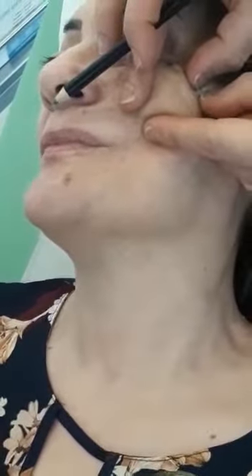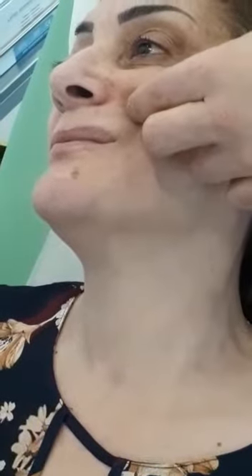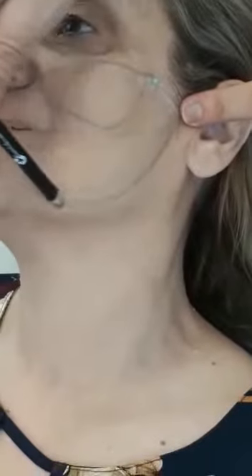Now I'm giving a general explanation, and then, of course, I will point out what we're going to do with her. If you do like this, when you put tension, this will happen. So, suspension effect, but also gain in volume. And the same here. Do that. Don't do that, because this is not natural.